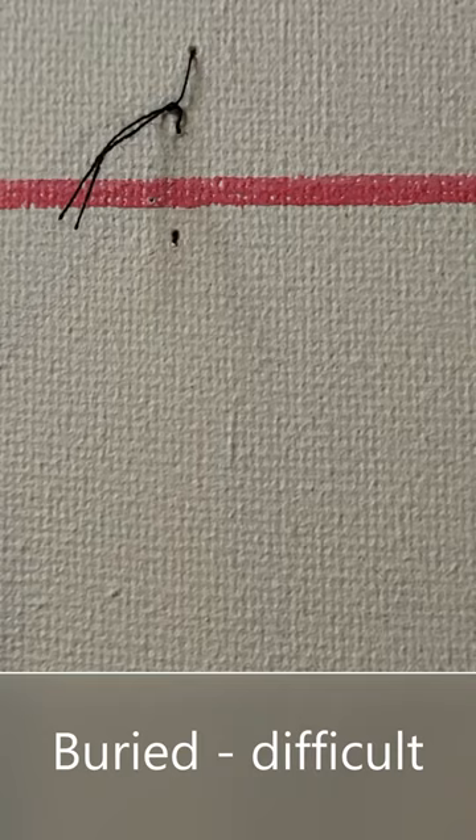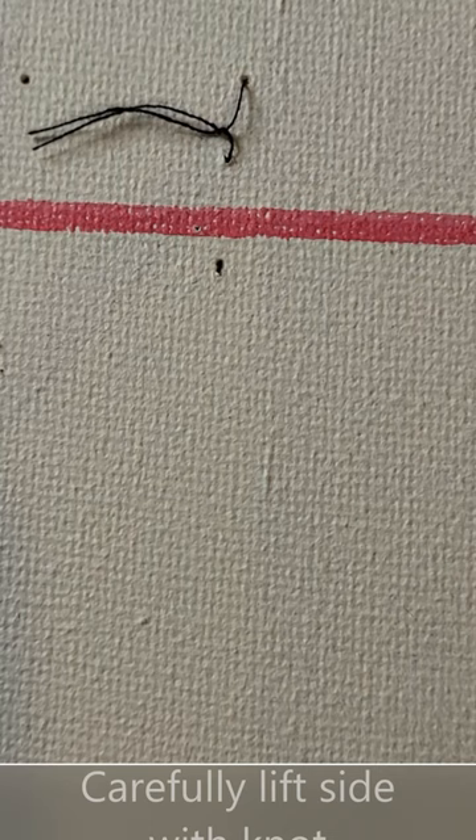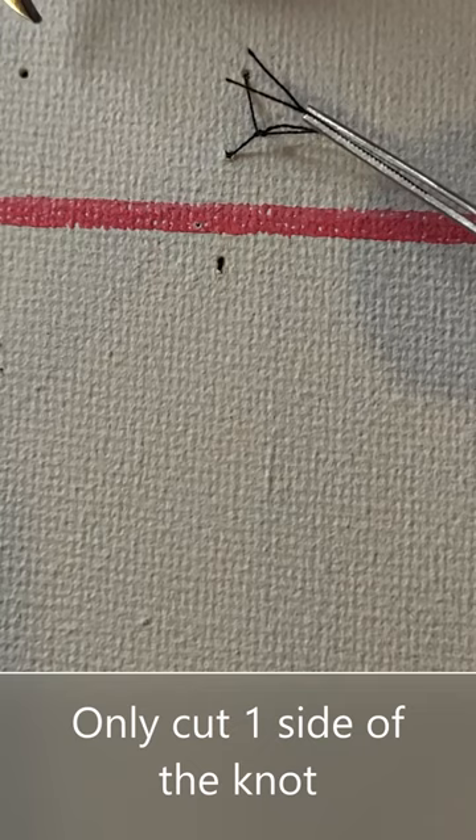Sometimes a vertical mattress suture is more buried and not as obvious — you may not be able to see how it's buckled under the skin. Again, it's very important to only interrupt it on one side. Lift it up as much as you can, ease your instrument underneath even if you have to dig into the skin slightly, and interrupt it. Then slowly pull out all parts of the stitch safely. Don't cut both sides or the rest of the stitch will remain in the skin.